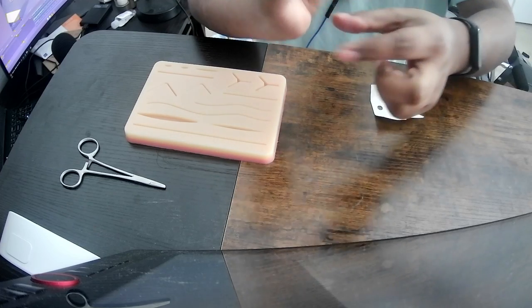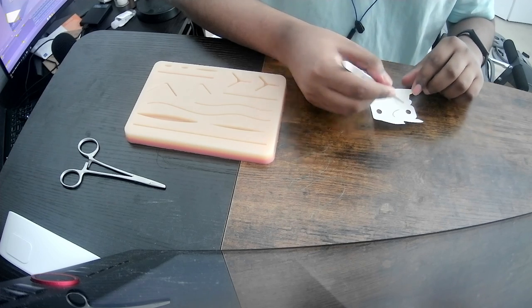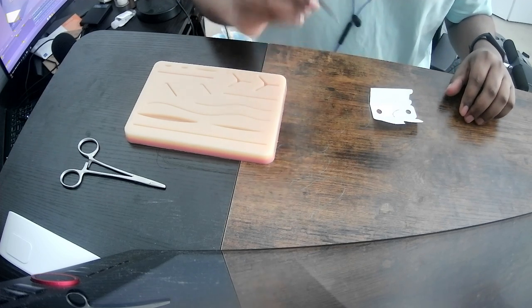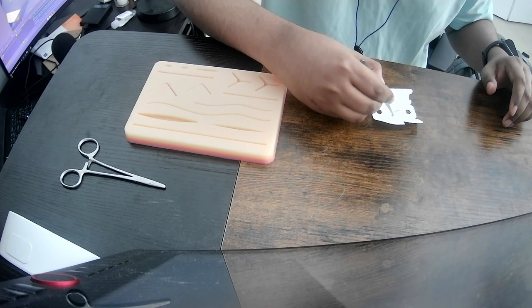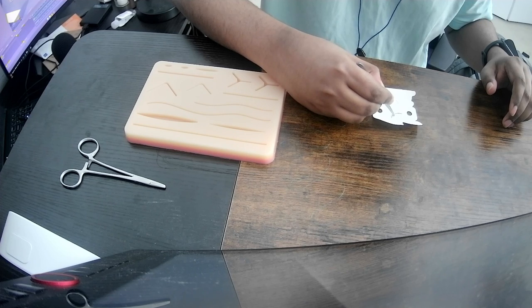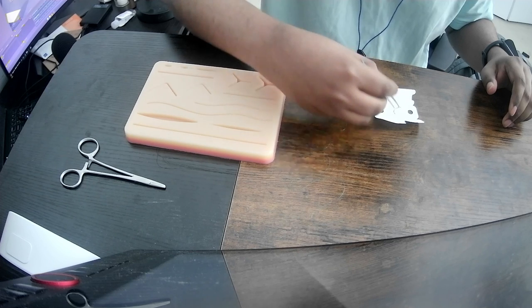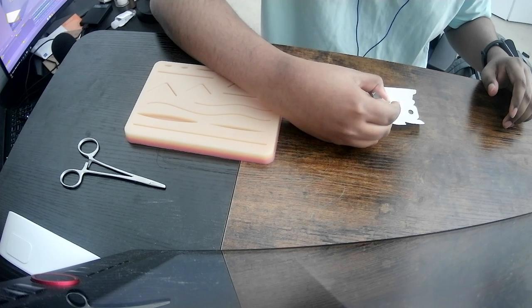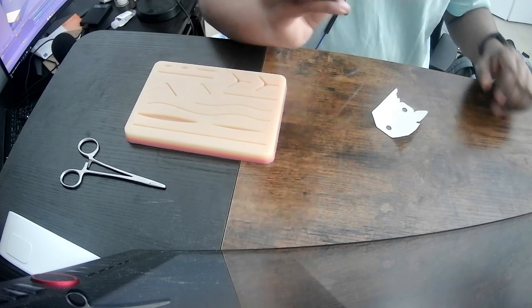As you can see, the suture is attached to the needle. It's kind of sticky. It almost, I don't know. Interesting. It's kind of delicate. I don't know if there's a proper way to pick it up. Okay. Now it's ready to be loaded.